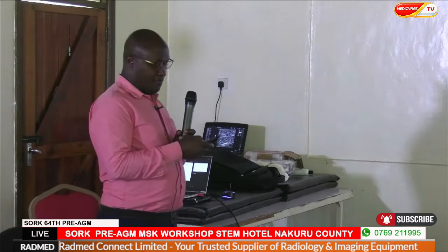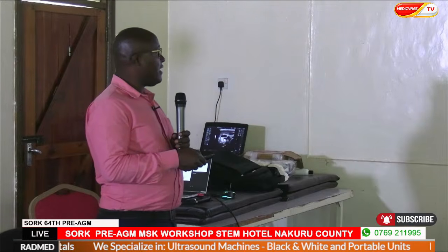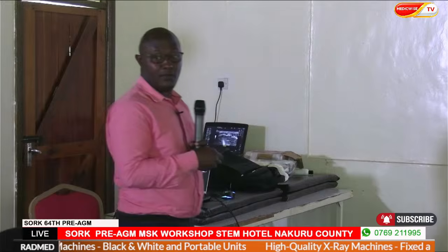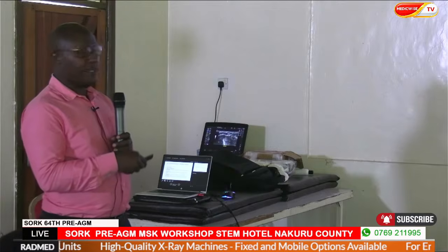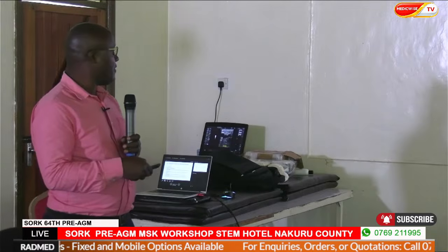So, ultrasound appearance of peripheral nerves. Peripheral nerves are these nerves which we can see with ultrasound, like the sciatic nerve, the ulnar nerve, the radial nerve, median nerve. So fascicular organization, nerve fibers grouped into fascicles. This one we've already seen on the previous image where we showed the perineurium, endoneurium, and the epineurium. So you just remember that image. These are the layers: endoneurium, perineurium, and epineurium.